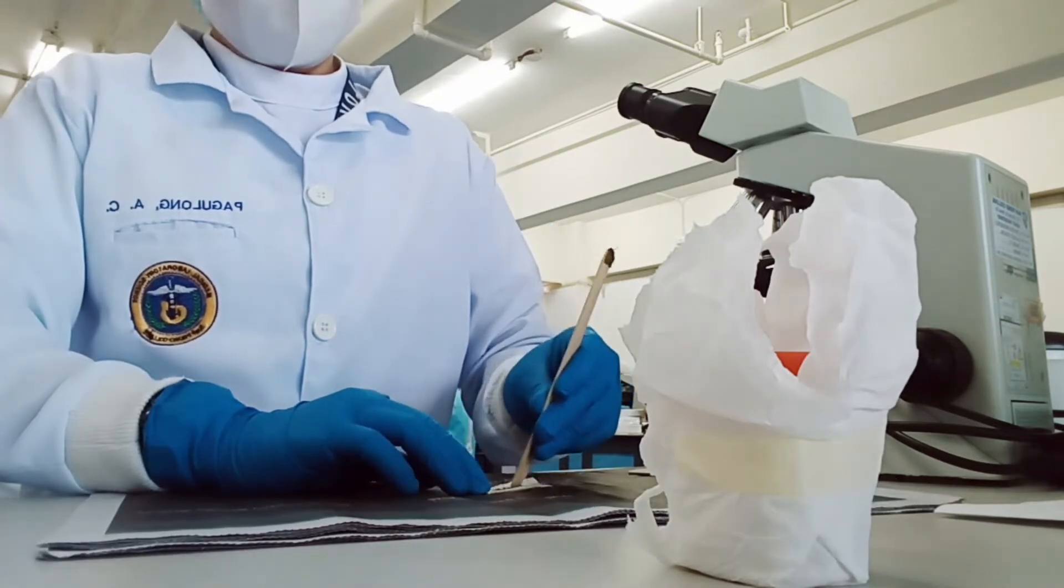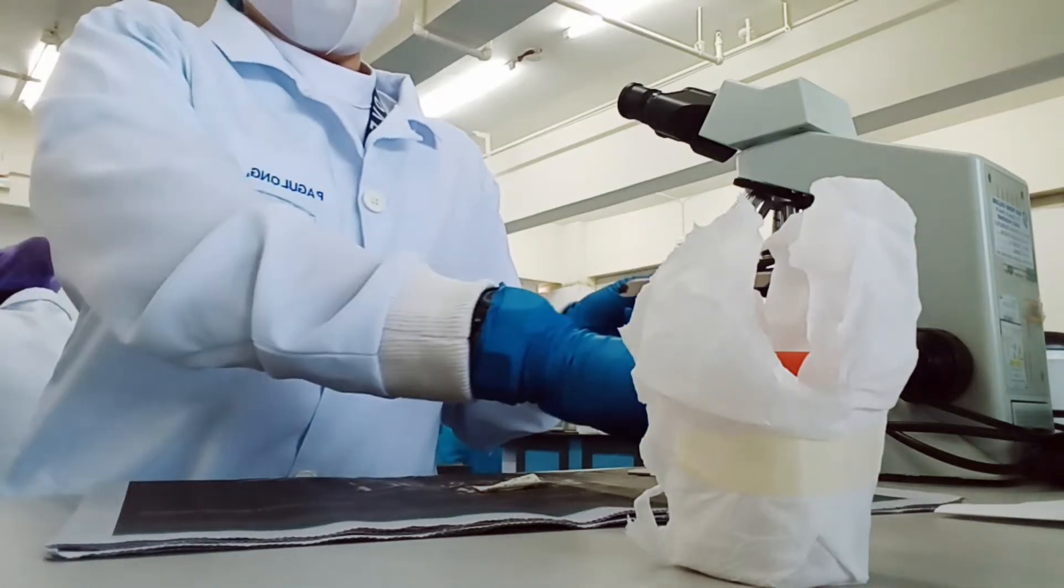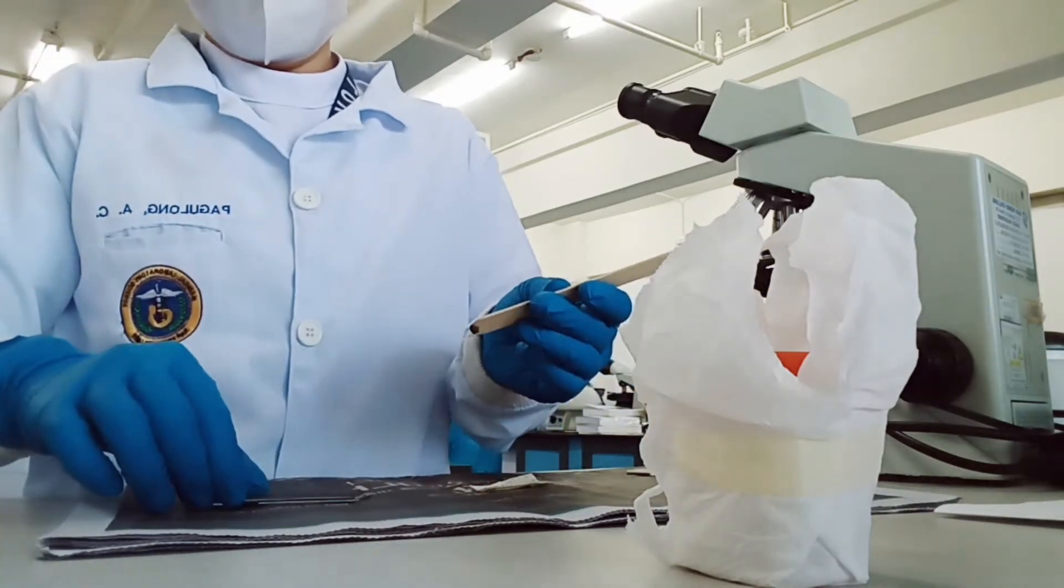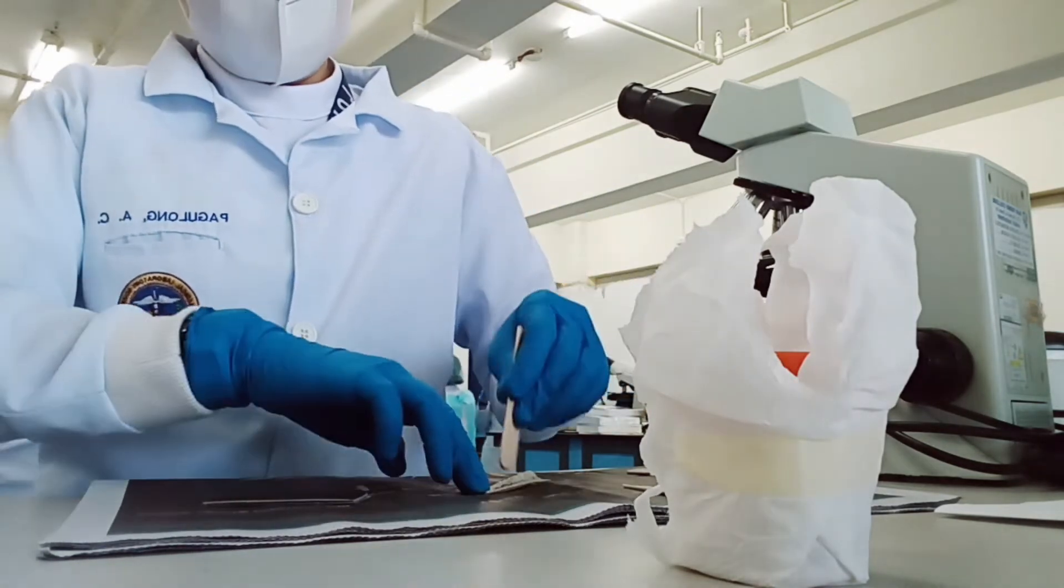Then scrape the sieved fecal material through the screen so that only the debris remains. Get the Kato-Katz template with the slide and scrape up some of the sieved feces to fill the hole in the template.